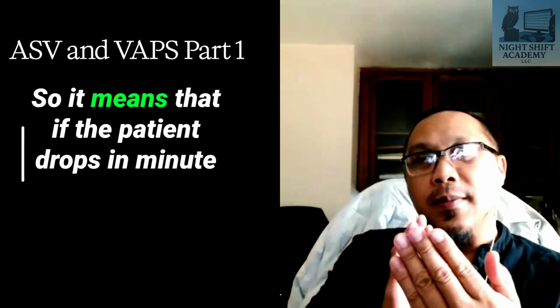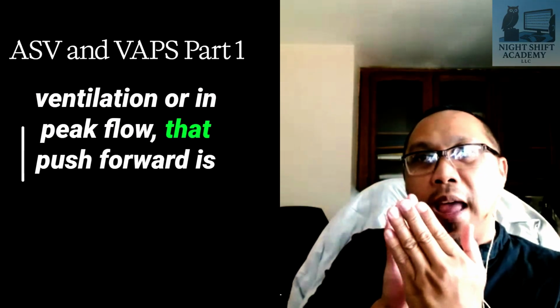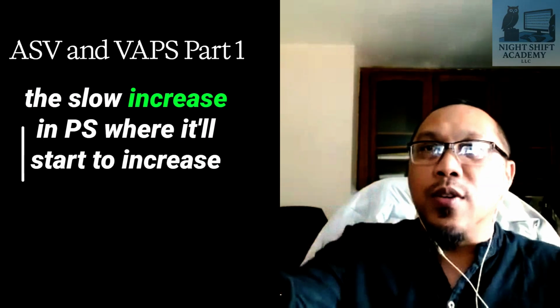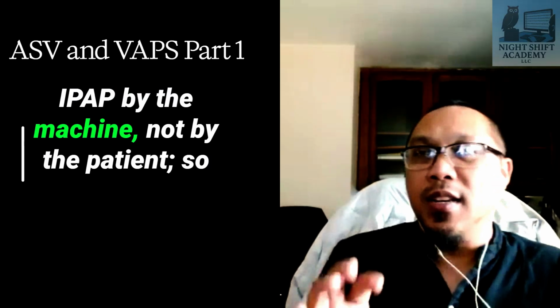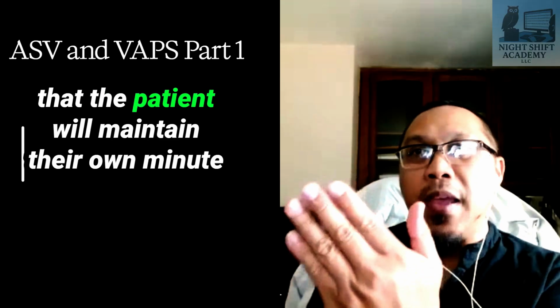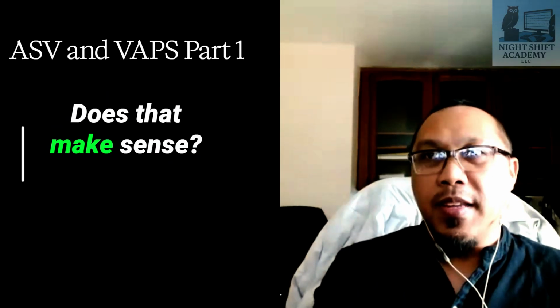Now, ASV will have somebody behind you who is perfect in their pace. So if you start to slow down, this pacer behind you pushes you forward. They maintain their pace. Okay, so it means that if the patient drops in minute ventilation or in peak flow, that push forward is the slow increase in pressure support, where it will start to increase by the machine, not by the patient, so that the patient will maintain their own minute ventilation or peak flow. Does that make sense?